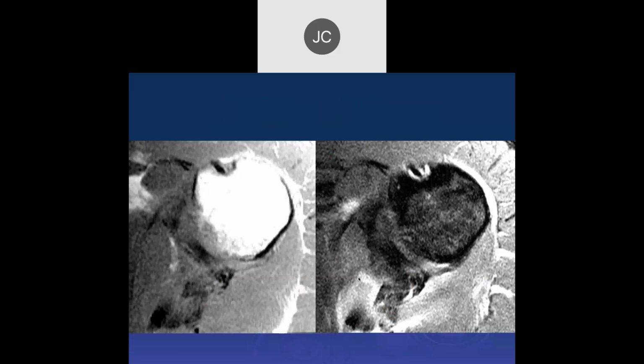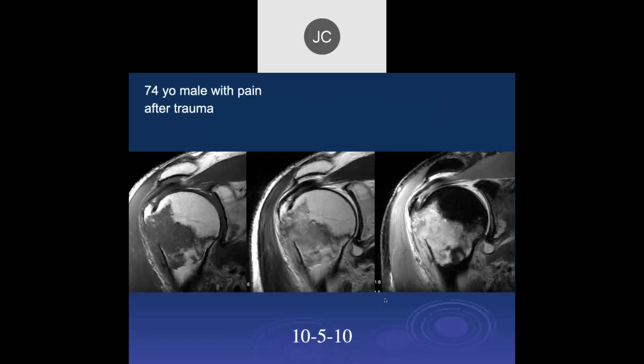Okay, so once again here, medial to the glenoid, there's irregularity of the scapula. You guys are picking up on this. Yeah, so repetition sometimes is helpful, but it can be difficult if you're just looking through a big stack of films and you're looking at rotator cuff tears.